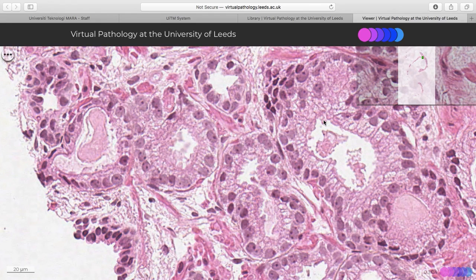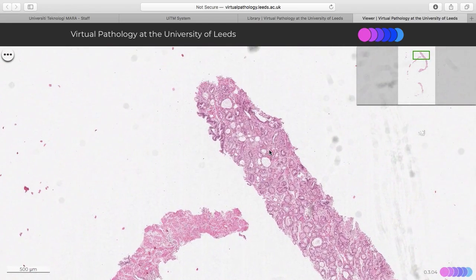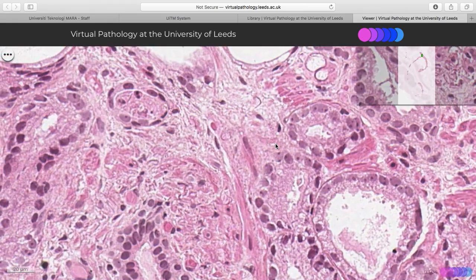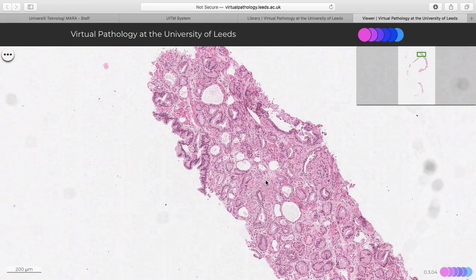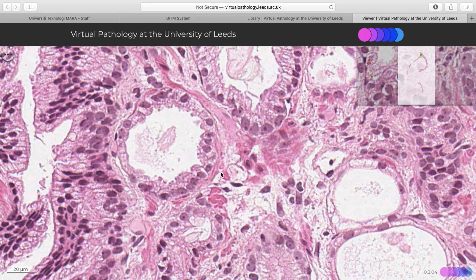There are other characteristics that you may see in some other biopsies, but they're not present here as I move around. Prostatic carcinoma tends to have a predilection for perineural invasion, especially in a prostate resection. You may see these malignant glands encase or invade into the perineural space, so the nerves basically. That's one of the characteristics.